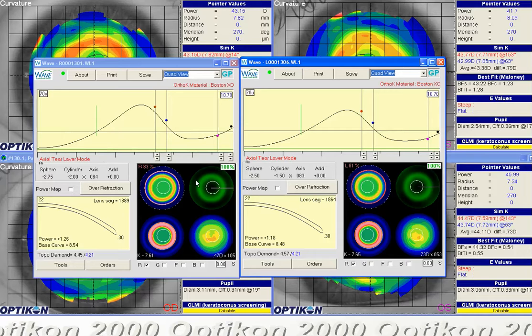Molding cylinder out of the cornea, a very toric cornea, is possible. It's not very easy. Molding cylinder into the cornea to counteract any internal astigmatism is probably even harder. So if you hold up some minus sphere trial lenses and the patient is pretty happy at plus 50 minus 1 or plus 75 minus 1, I think that target would be easier to get to. And I'll show you how I would do that.